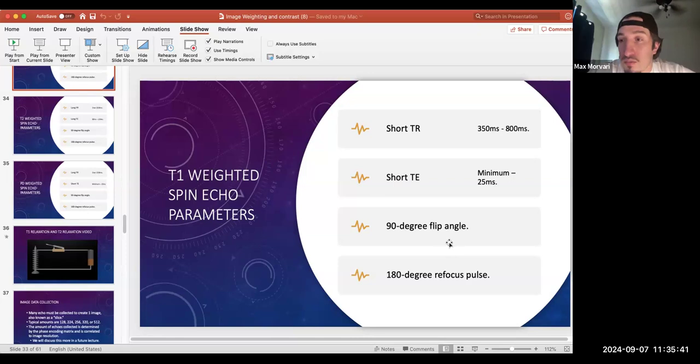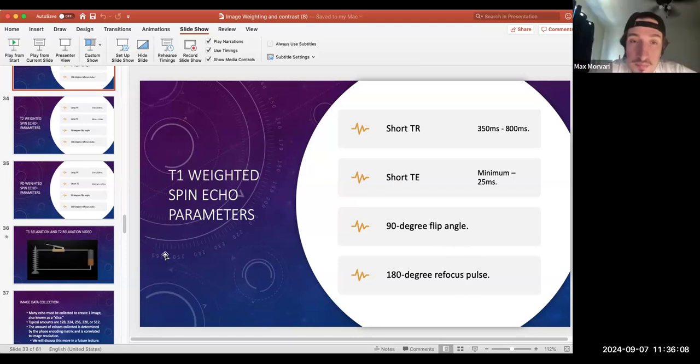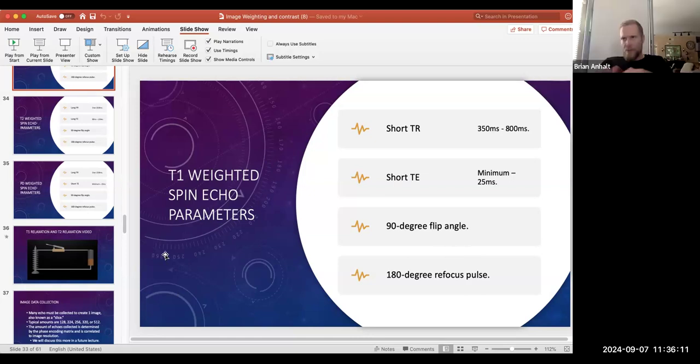Like the spin echoes and the refocusing pulse, and what I'll get back in terms of an image. I just want to be able to connect that with the TR, TE, T1 relaxation, T2 relaxation, and all of that. Yeah, it's important to understand why it's happening. So you've got to break it down into each individual component. What is a short TR doing? What is a long TR doing? What is a short TE doing? What is a long TE doing? What are the mixtures of those doing?